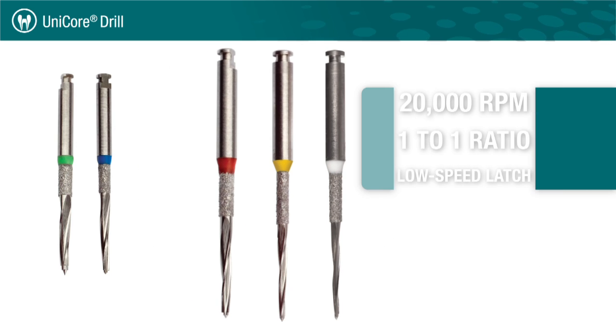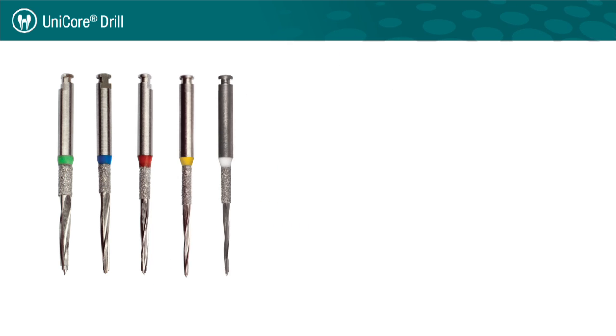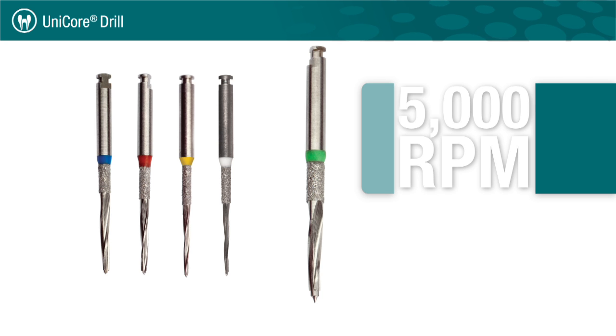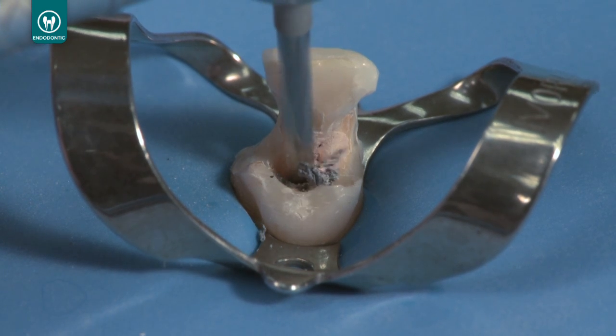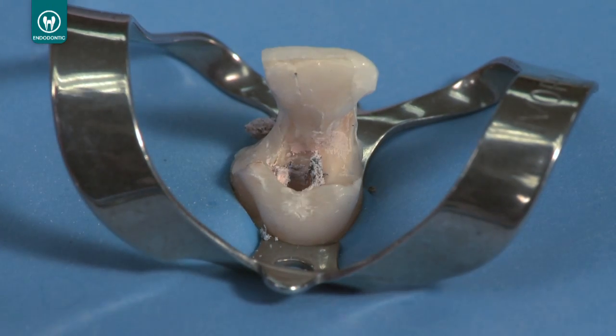The size 0 to 3 Unicore drills run at 20,000 RPM in a 1 to 1 ratio low speed latch. The size 4 Unicore drill is the only one that runs at 5,000 RPM. Always have the drill running full speed while entering, preparing, and exiting the tooth.